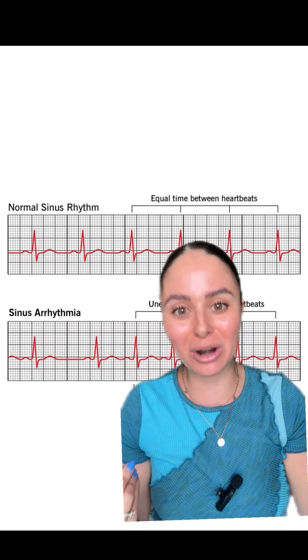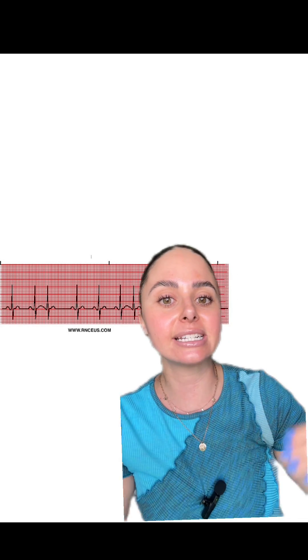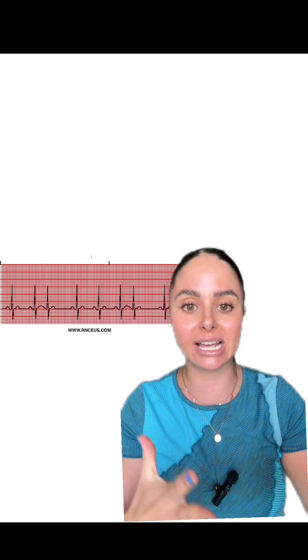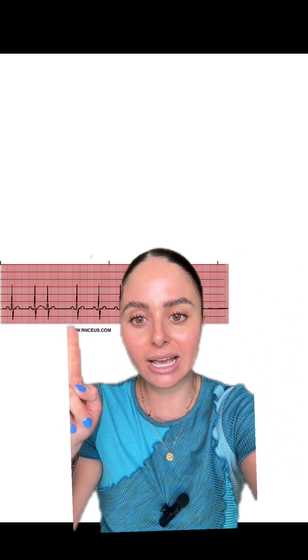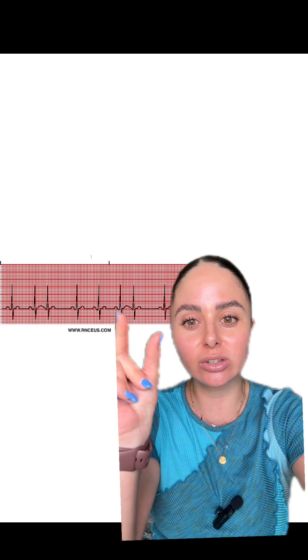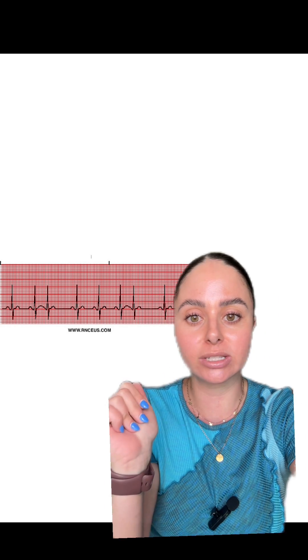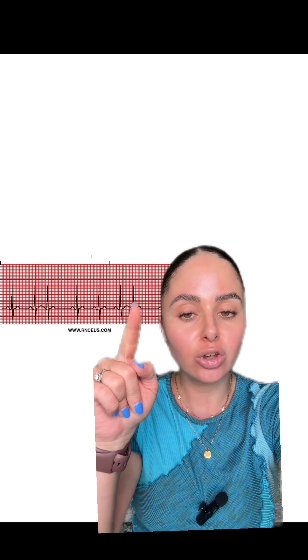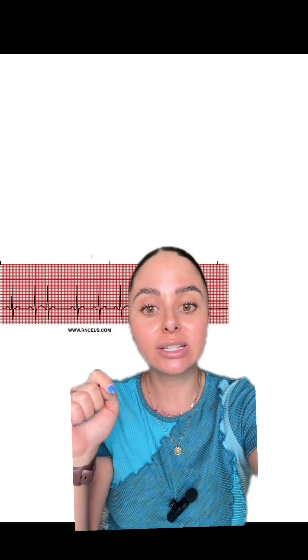It can be kind of tricky to tell if this is a sinus arrhythmia versus a normal sinus rhythm with PACs. Looking at this strip, you can see a couple of PACs — one here and one here. Even though you still see closer intervals and then further intervals, for a PAC your P wave is either going to be gone or look different than your normal sinus P waves. Here there is no P wave because it's a premature atrial contraction.